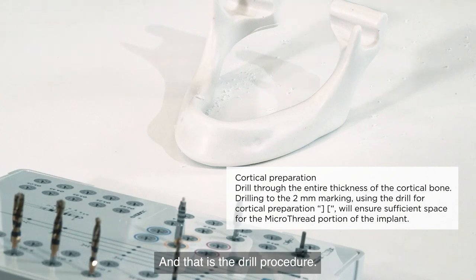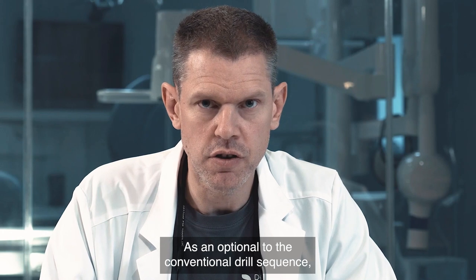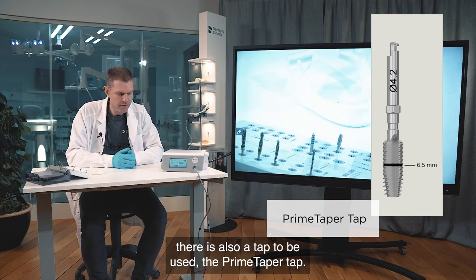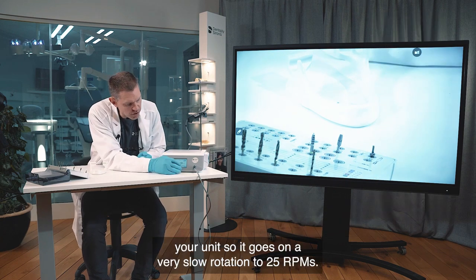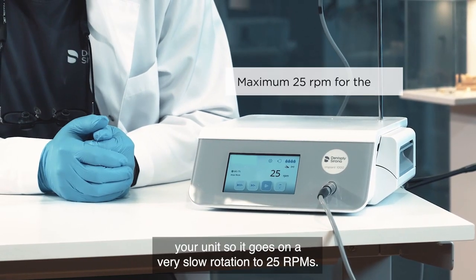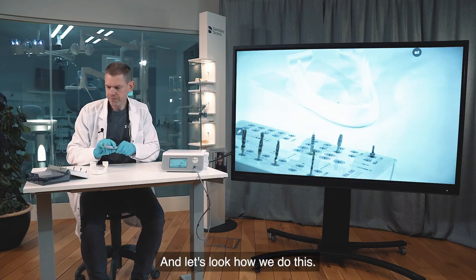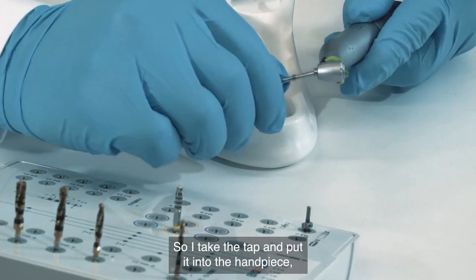That completes the drill procedure. As an optional step to the conventional drill sequence, there is also a tap to be used — the Prime Taper tap. To use it, you need to adjust your unit to a very slow rotation of 25 rpm. Let's see how we do this: I take the tap and put it into the handpiece.